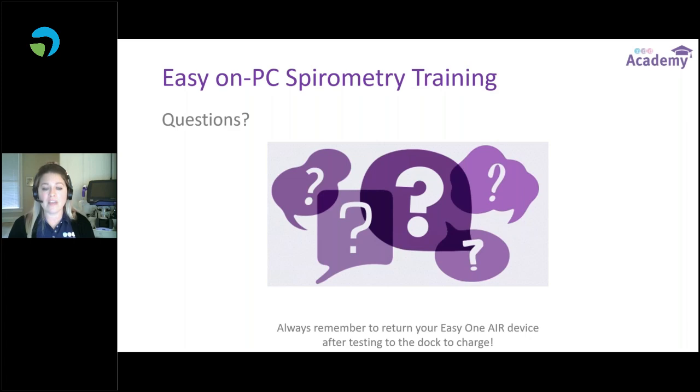If you've used other devices that have you breathe in, seal, and then blow, our device absolutely can function in that way. I just prefer teaching the entire maneuver on the mouthpiece because there's a lot less patient error that way. Great. And the last question I have right now is, will your PowerPoint be shared with us? Oh, I can definitely share it with you guys. What I will probably do is convert it into a PDF document and attach it to the post-webinar email that will come with this recording. It will come with the recording included, but I can attach this presentation as a PDF document if that would be helpful.